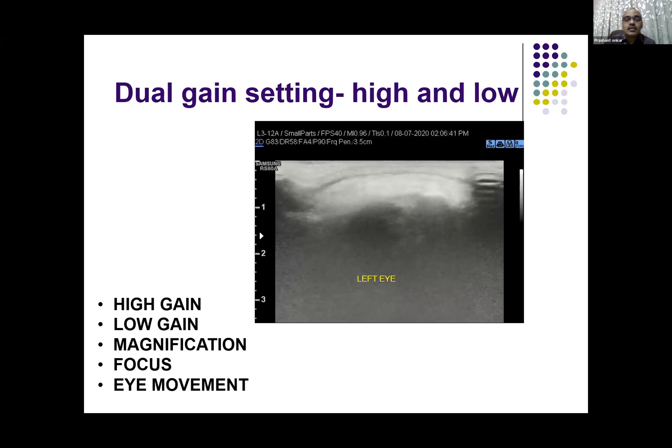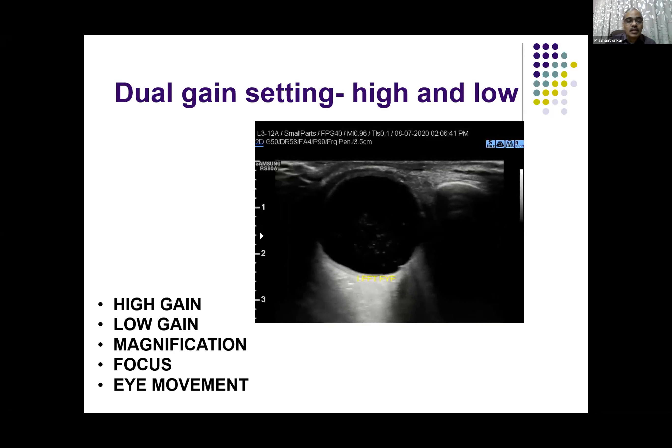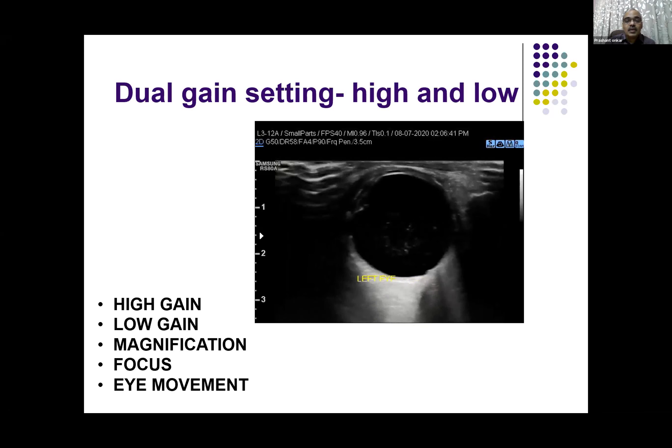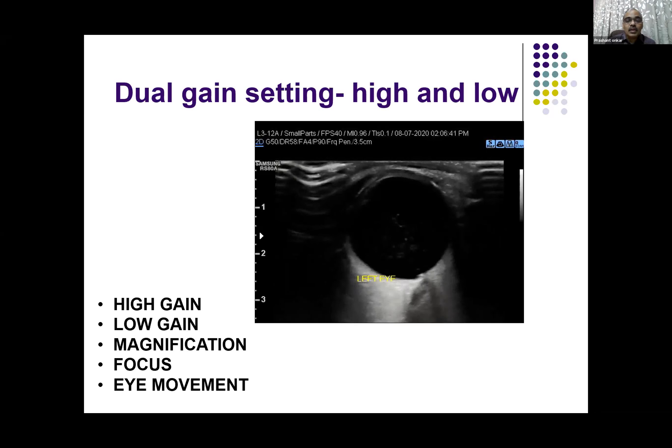So how do you do an ultrasound B-scan? We use two scan settings: high gain for the anterior chamber and low gain for the posterior chamber. In high gain, you can see the cornea, iris, ciliary body, and anterior chamber.